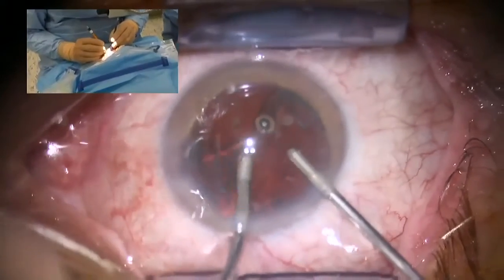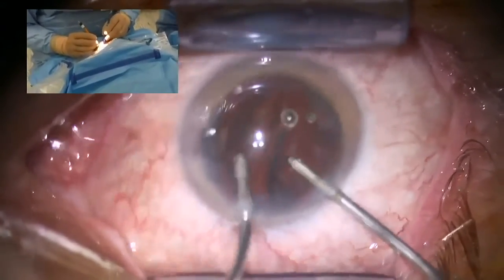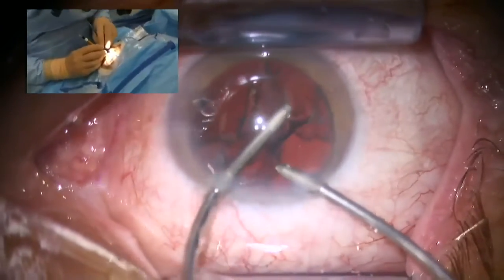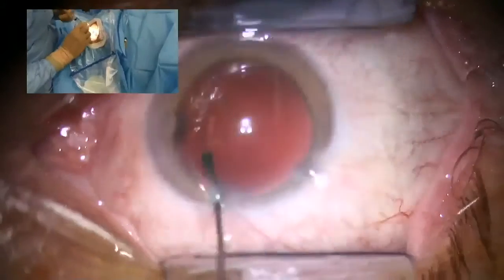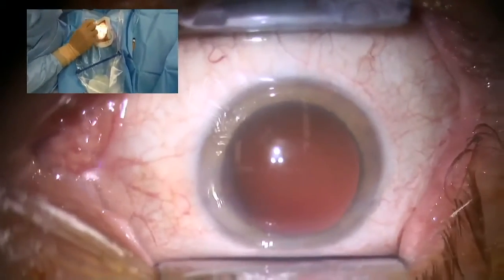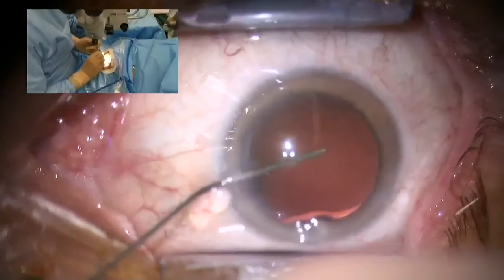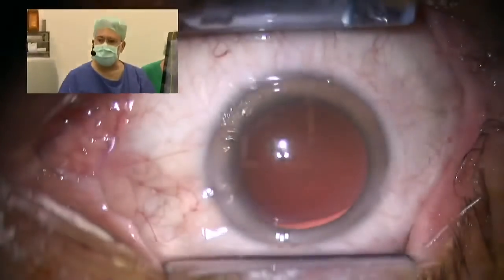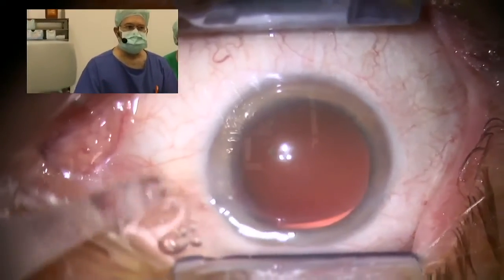So here the posterior part of the lens is a bit more sticky on the capsule. Again, cleaning the posterior capsule with a water jet, preparing for the implantation of the basic IOL. Your nanolaser technique seems to be very advanced. Do you find any differences between phaco and the photofragmentation at this stage of your use of this system?